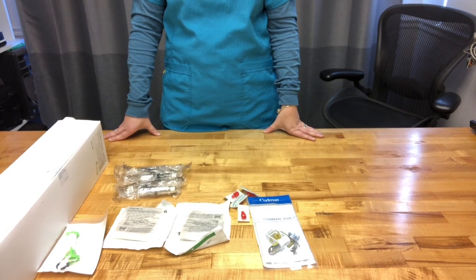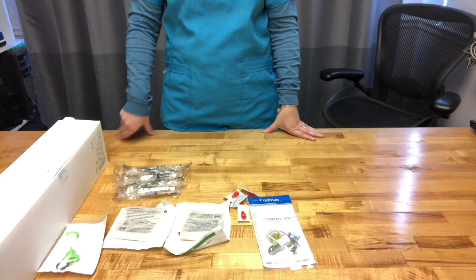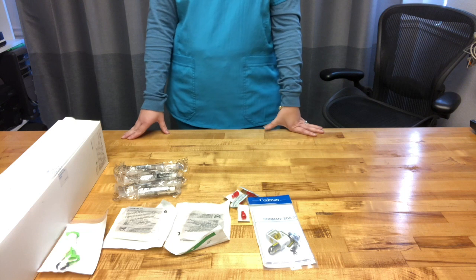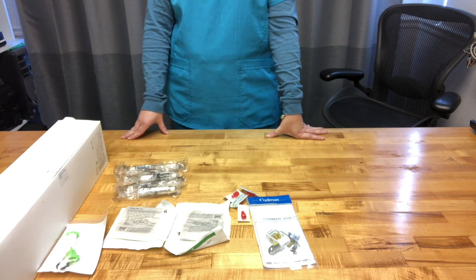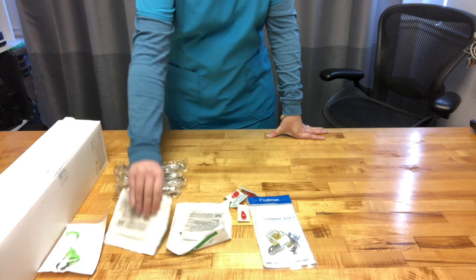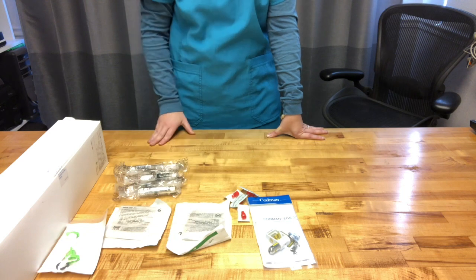This video will show you how to appropriately set up, maintain, and troubleshoot drainage of CSF and monitoring of ICP with the Integra AccuDrain External Ventricular Drain Set. Supplies for this simulation include the AccuDrain, sterile preservative-free saline, Integra or Codman catheter, cranial access kit, external transducer as needed, and PPE including sterile gloves and a mask. Mask not pictured.